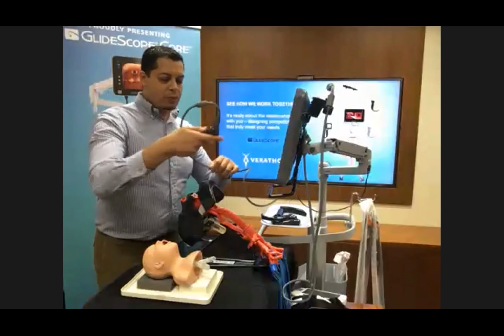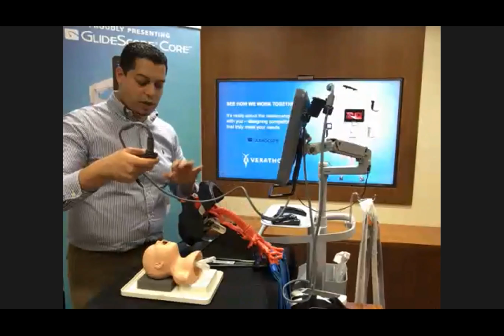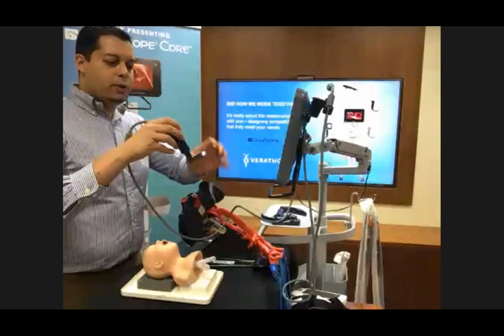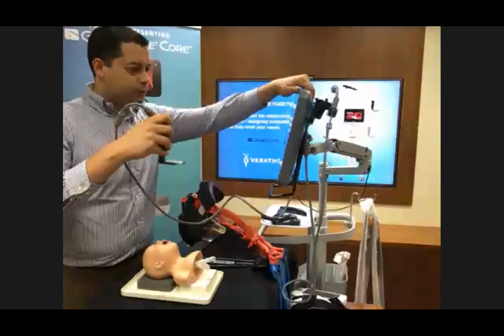And in addition to that, we will do a video endoscope. Let me do a quick demonstration on the pediatric and adult mannequin. We'll use this Miller blade on pediatric size 0.